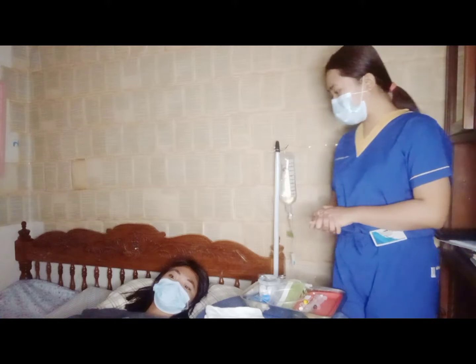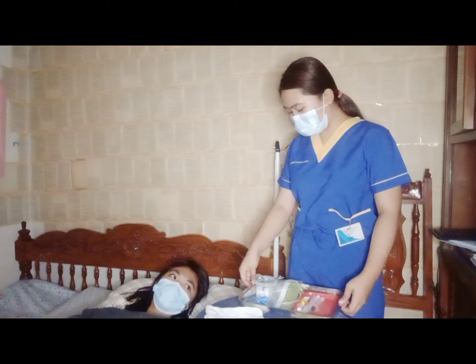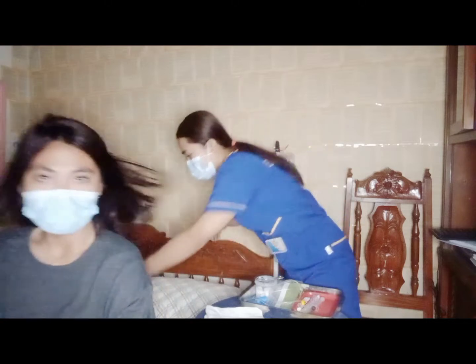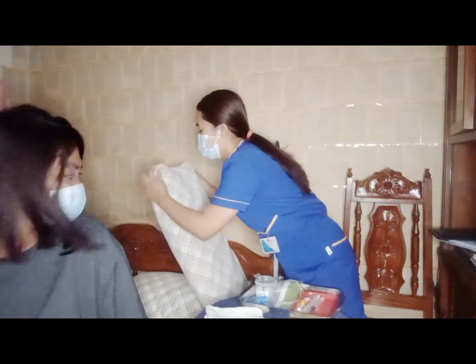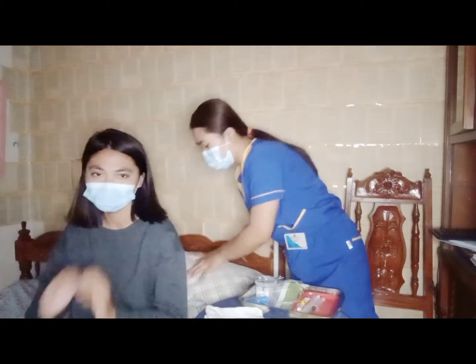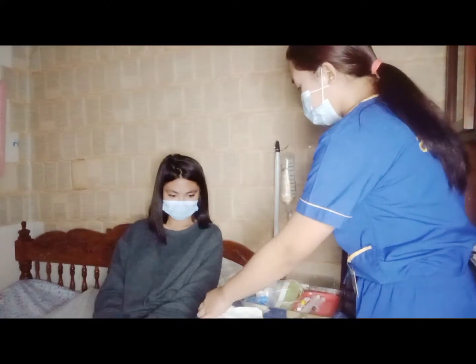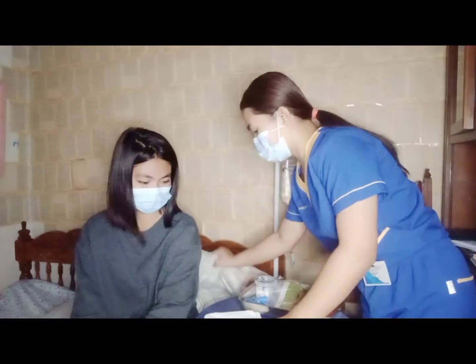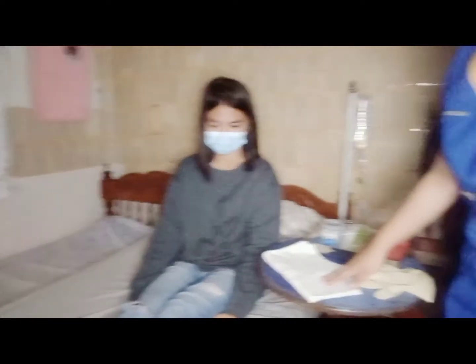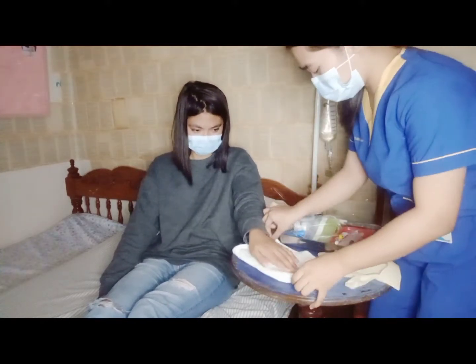Kamusta ang pakiramdam mo, ma'am? Okay naman po, ma'am. Kinakabahan ka ba, ma'am, sa procedure natin ngayon? Hindi naman po. Okay. Pwede po bang upo muna kayo saglit? Dagdagan ko lang itong unan ninyo para sa comfortable position ninyo during our procedure. Ayan, comfortable po ba kayo? Opo, ma'am. Okay. Pakipatong na lang kamay niyo, ma'am.